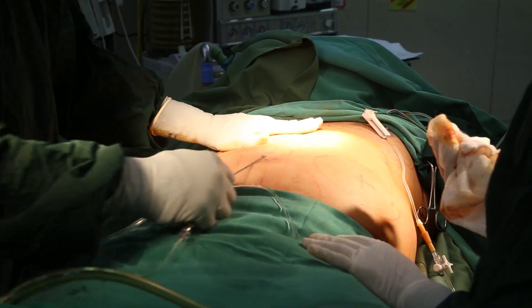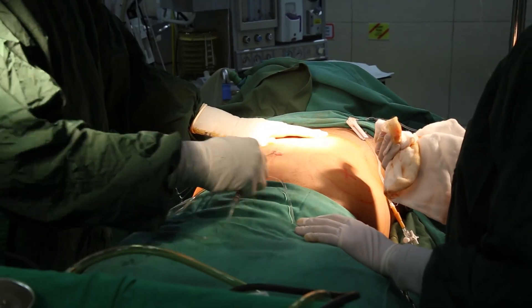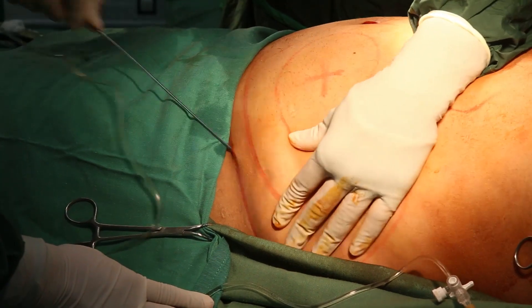All instruments are sterile and introduced through a small stab mark. These cannuli come in various types to suit the situation, and selected cannuli are used. These stab marks are placed in areas that will not be visible, such as in the groin fold.